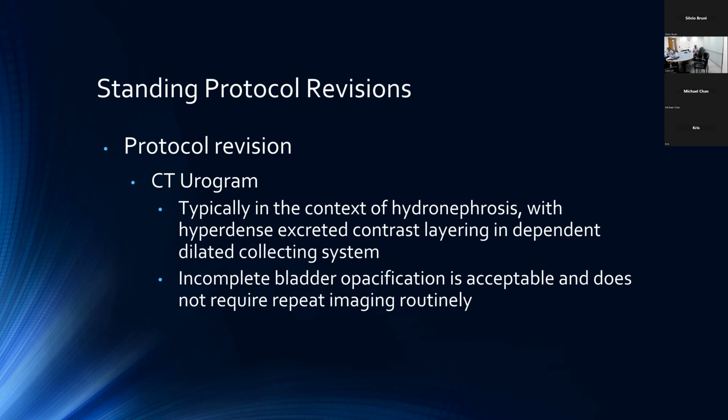But really the obstruction is the primary reason that we're doing the exam. It's the primary thing that we're looking to characterize with these urographic phase images. So as best we can, we should be attempting to get contrast down to that level of obstruction.